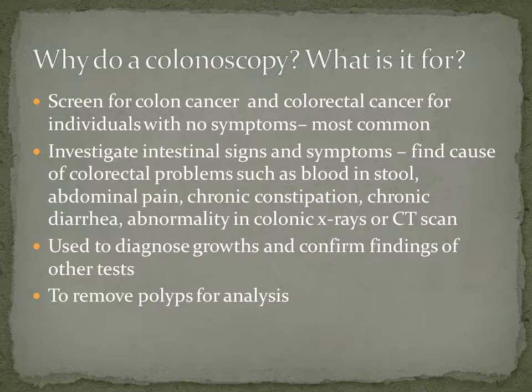It is also used to diagnose growths. It helps to find ulcers, colon polyps, tumors, and areas of inflammation and bleeding. Colonoscopy can also be used to remove polyps, abnormal growths, and to collect tissue samples or biopsy for analysis.